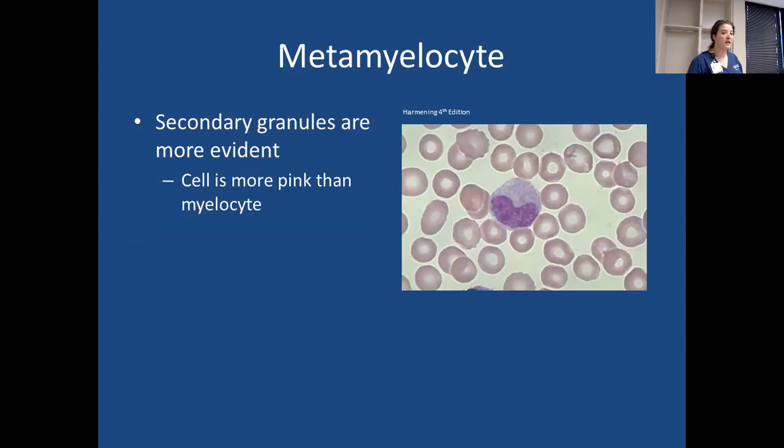And you should have secondary granules. They should become more prominent as the cell matures as well. It's hard to tell in this image. It looks better for you guys actually than mine. So here's your granules. Little specks, those are your granules on top of the cytoplasm.